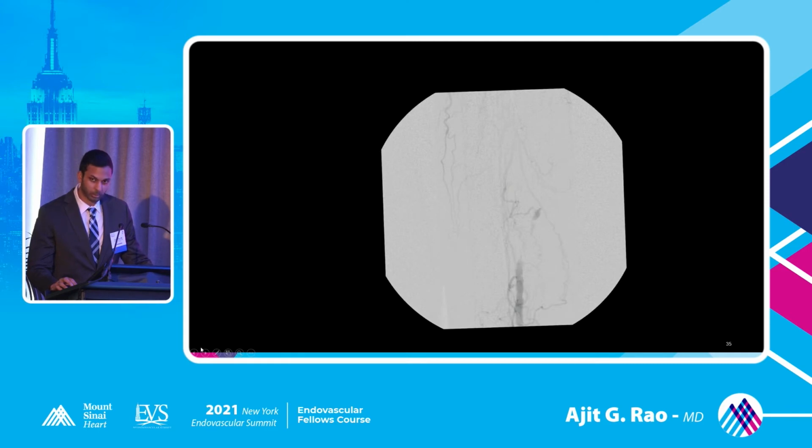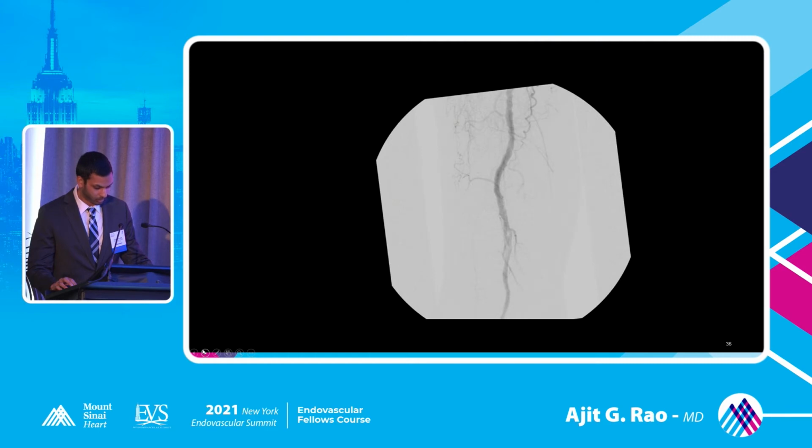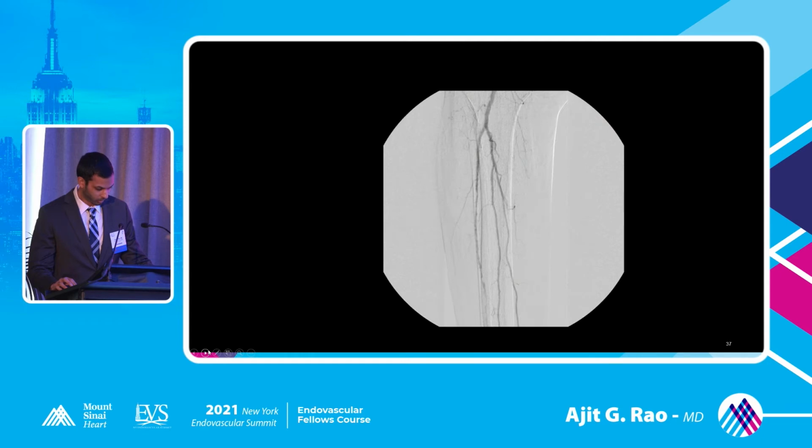Here we're looking right above the knee, which is where the femoral artery comes back. This is the popliteal artery that has a little bit of disease in there, but it's open. And then this is the runoff. So here you can see that there's 3-vessel runoff with a very diseased anterior tibial artery.